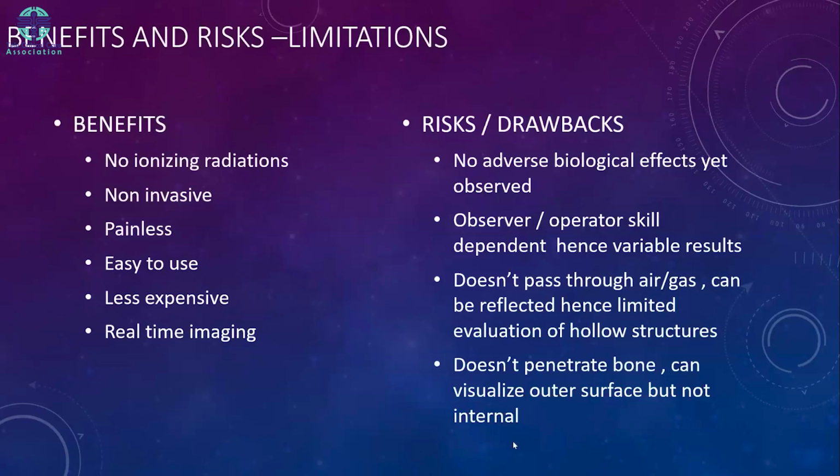There aren't any adverse biological effects that have been observed yet, but because it is operator or observer skill dependent, there can be variable results. It doesn't pass through air or gas, and is reflected, hence it has limited evaluation of hollow structures. It does not penetrate bone, and hence can visualize only the outer surface. No internal structures inside the bone can be visualized.